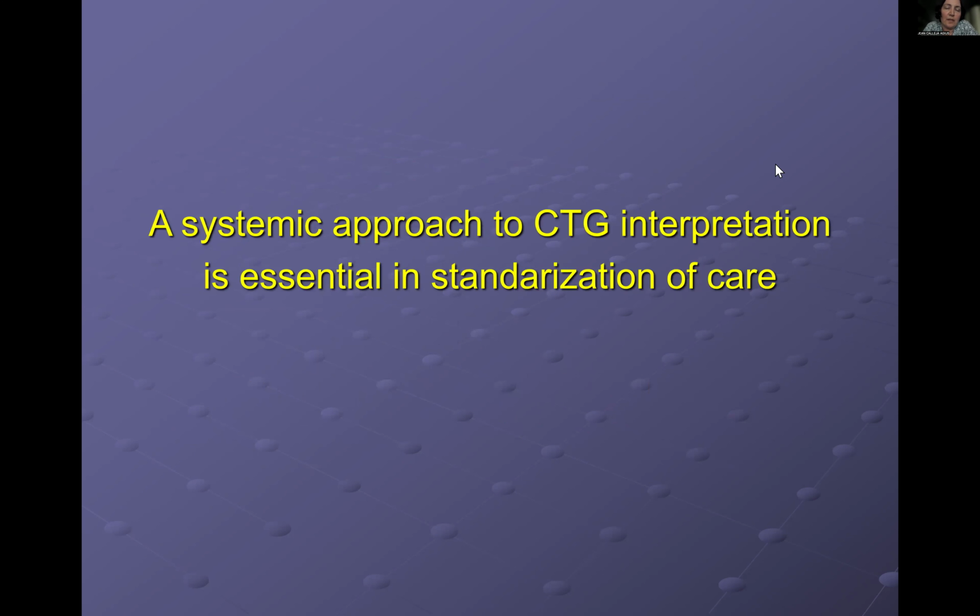So, as I said, to make it safer, it is recommended that there is a systematic approach to CTG interpretation. And why is that important? Because the person who is monitoring the lady during delivery, be it the birth attendant, the midwife, the doctor, it's important that if you are monitoring that labor and you realize that something is wrong, then action would need to be taken.